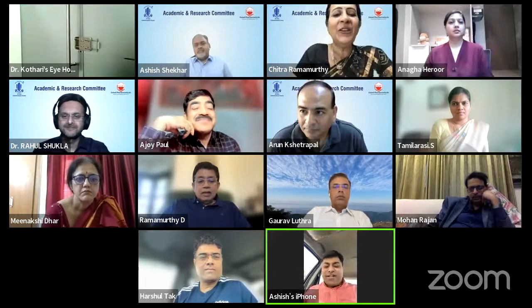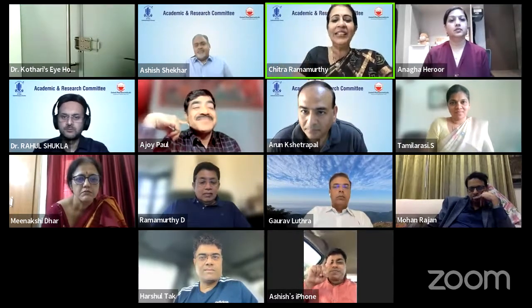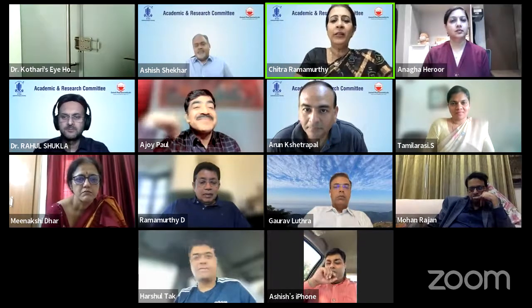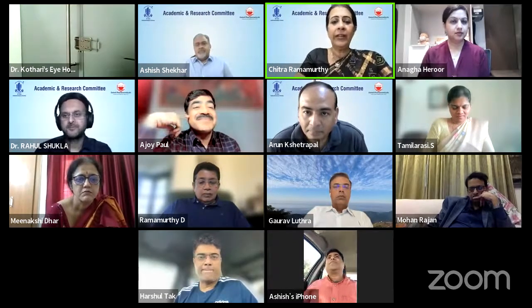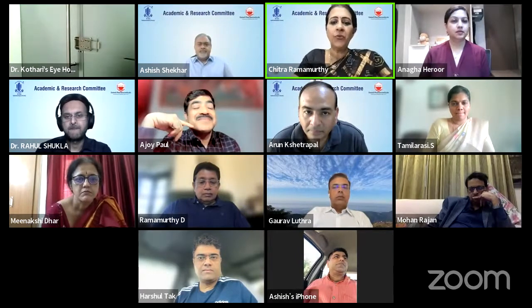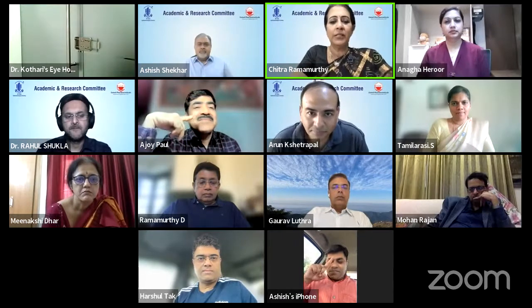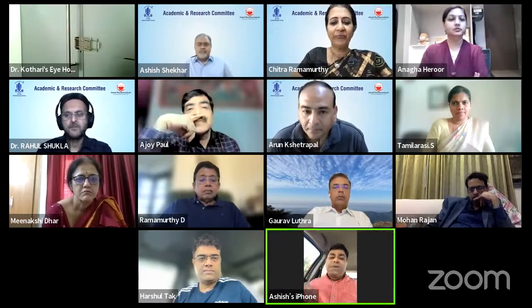I agree. I will put one further question and then take all your answers. Would any of you think that at that point of time, doing a pars plana vitrectomy would be a better option than doing an anterior vitrectomy? Yes, Dr. Ashish, you want to answer that? Ma'am, I'm a retina surgeon as well.